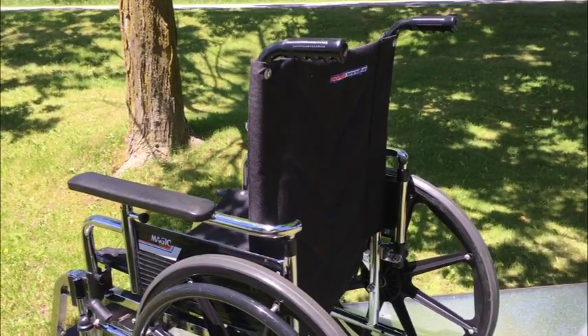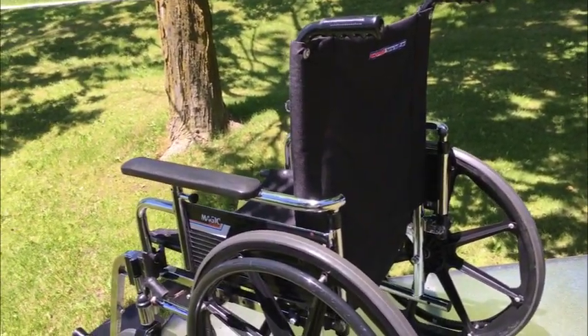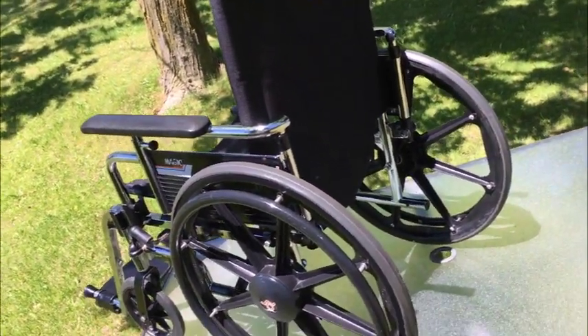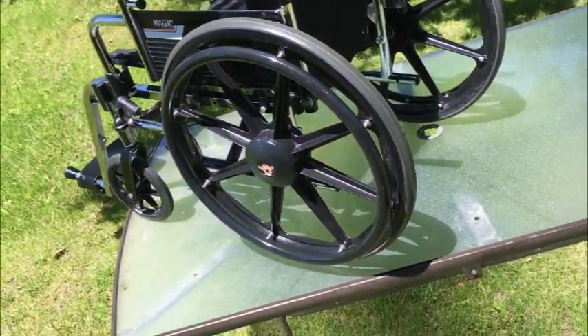Hey guys, my magic voyeur folding wheelchair. Let's go through it. If you need a wheelchair, you need a wheelchair — it's in great shape.